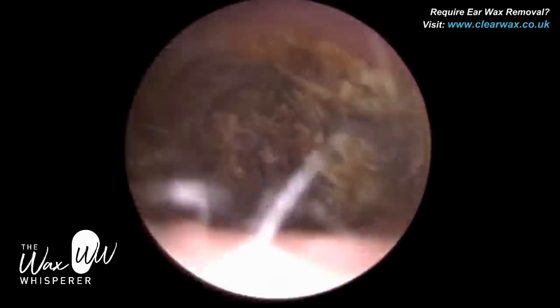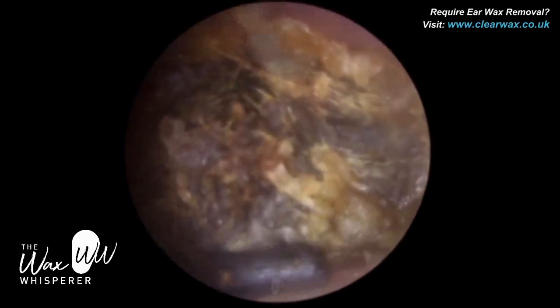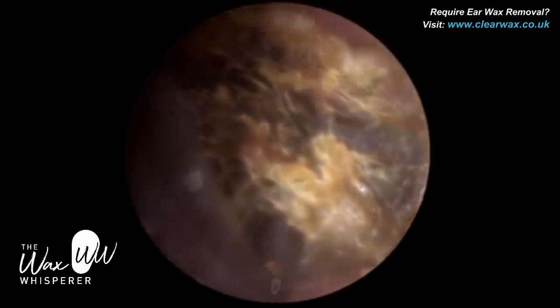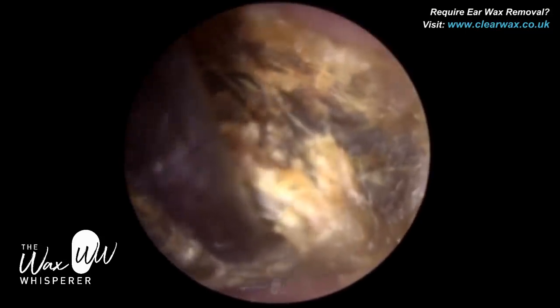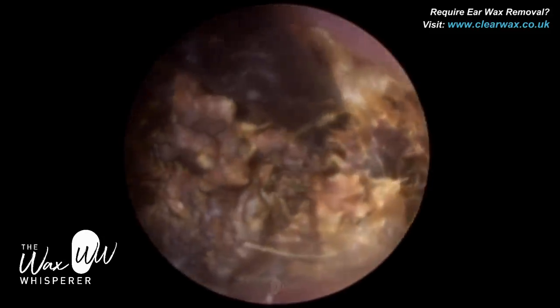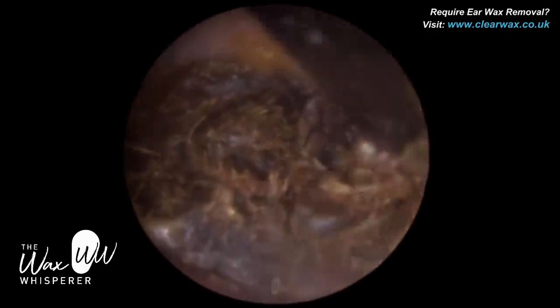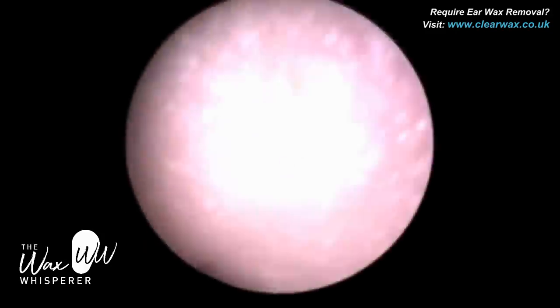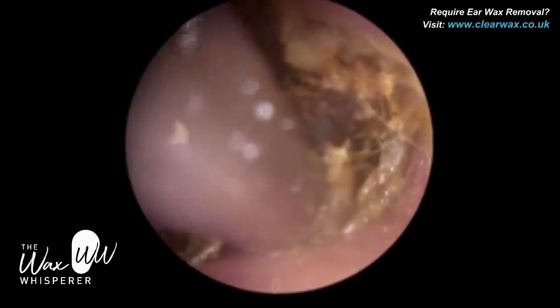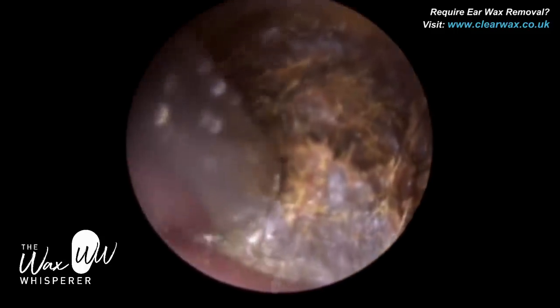The first priority when you remove earwax is to make sure your patient is as comfortable as possible. When you realise you need to step it up a level, you just pre-empt the patient — and you still need to be gentle; there's no excuse not to be. What I've done here is inserted the earhook inferiorly, trying to get it to the core of the wax, rotating it and trying to stab it in the middle. But it's just too hard — it glanced off the tip again.